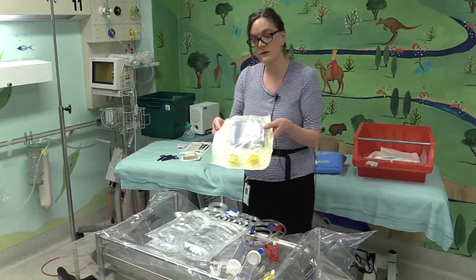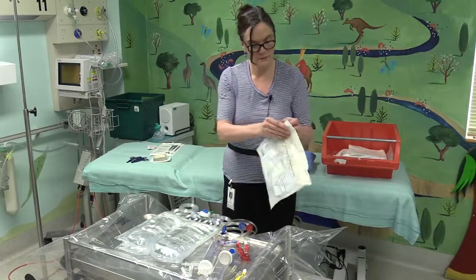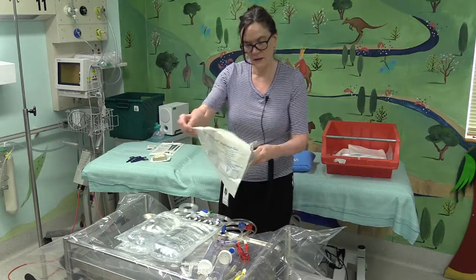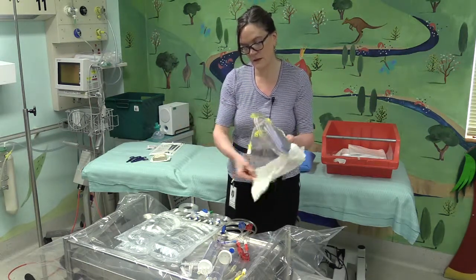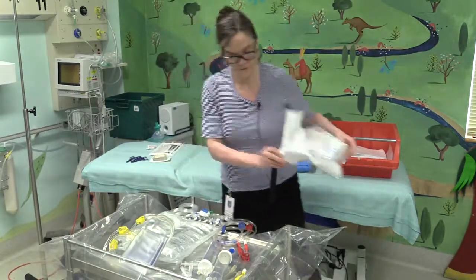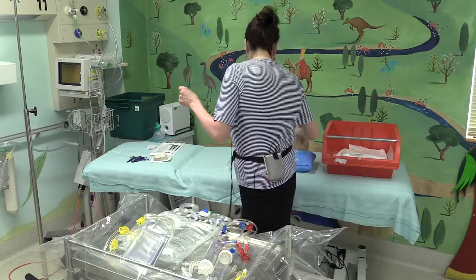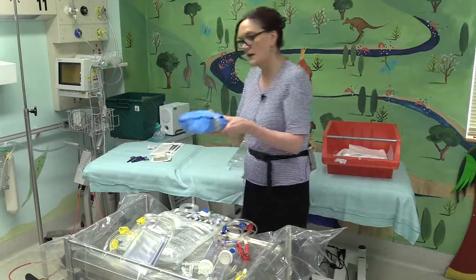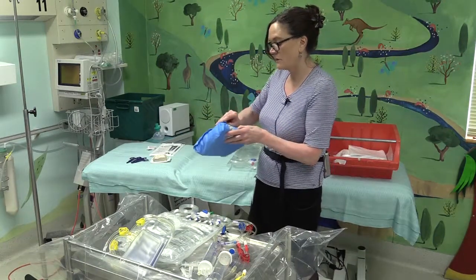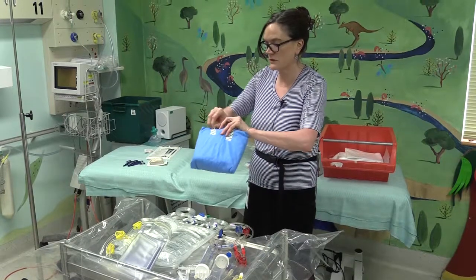I'm also going to use a large drain bag. I'll open up a gown and some gloves, which I'll be wearing after I've done my 3-minute hand wash.